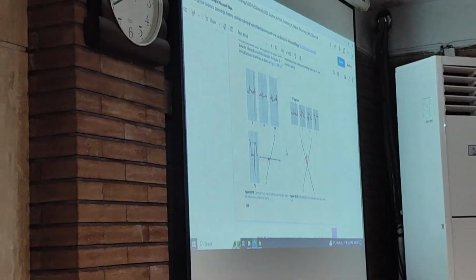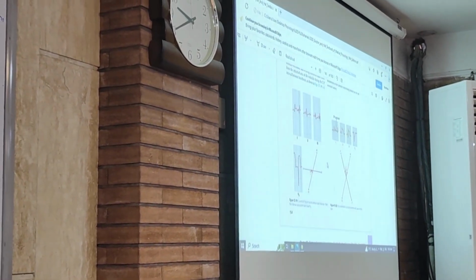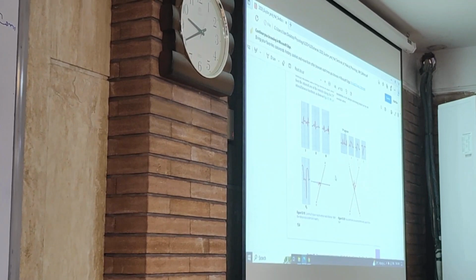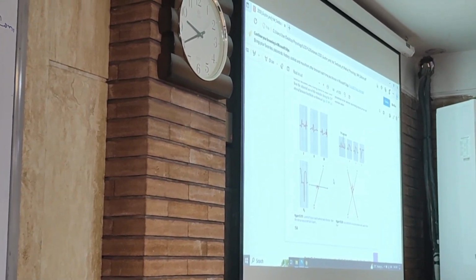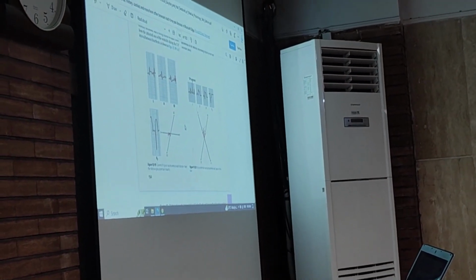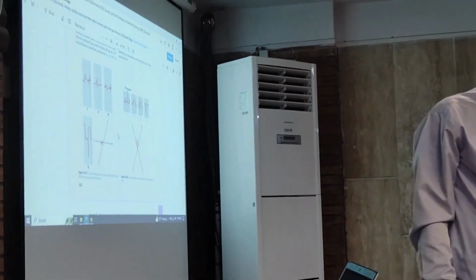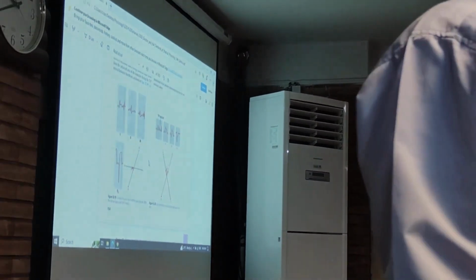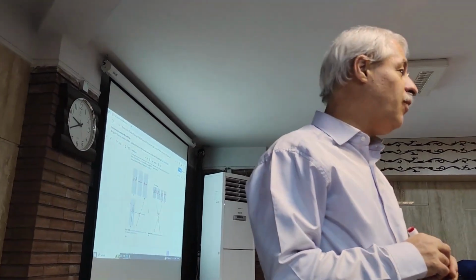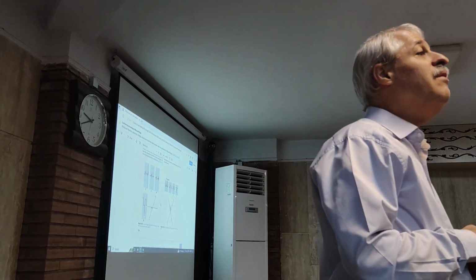When you come to clinic, take an ECG and see that you have ST elevation. As soon as somebody sees the ST elevation, there may be a thrombosis in one of the coronary arteries. For example, in left anterior descending, in right coronary, or some other coronary arteries. If there is a thrombosis, then you will have ST elevation, means infarct, acute myocardial infarction. If there is ischemia, you have T wave changes.